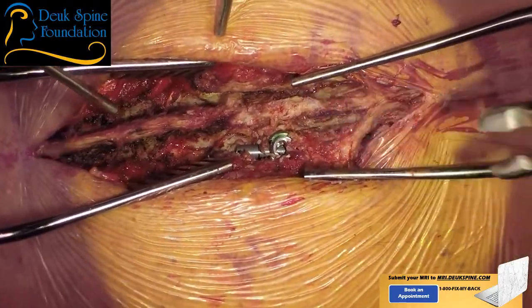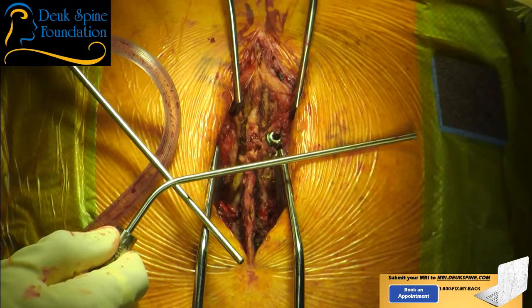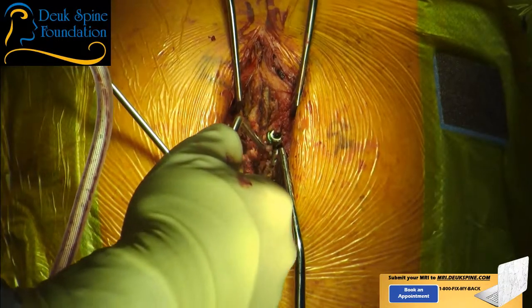And I'm going to look at the MRI one more time because as a spine surgeon, it's impossible to tell what level you're at because all the bones look the same except for a couple of exceptions in the spine. One of them is C1, C2, T1, I mean, you can usually count where you are based on those things and the sacrum. But maybe T12, L1 junction because of the rib. But I wouldn't count on it.